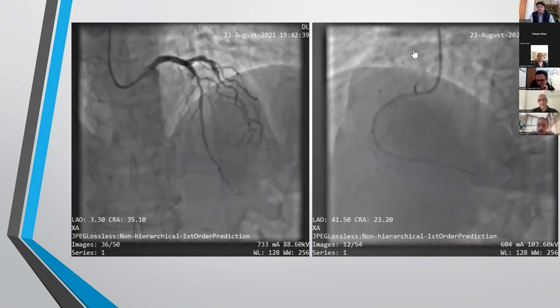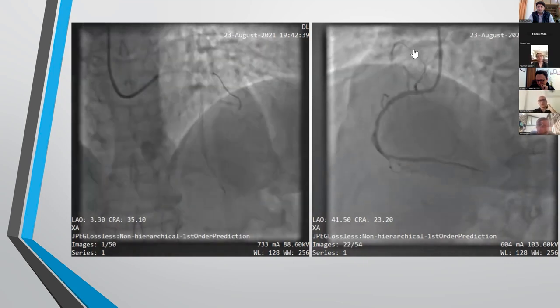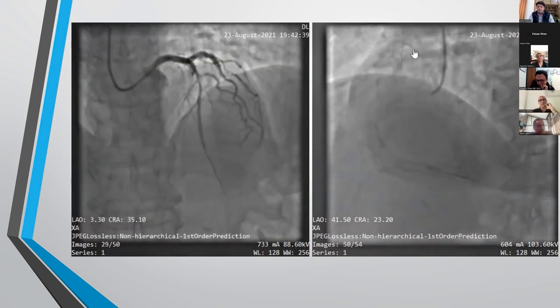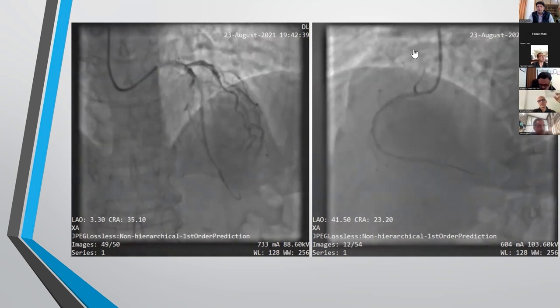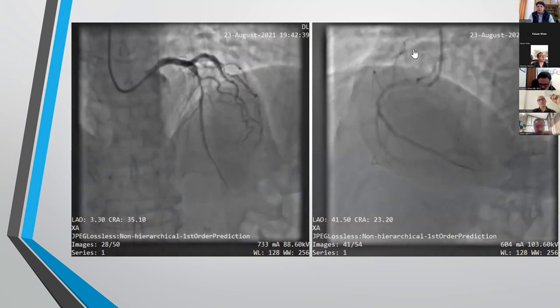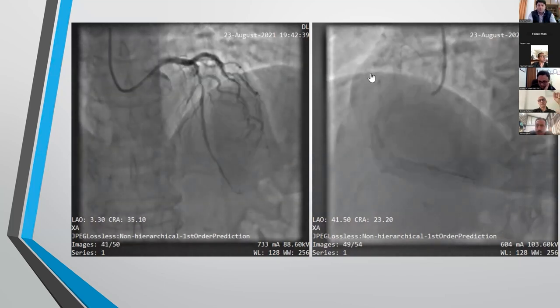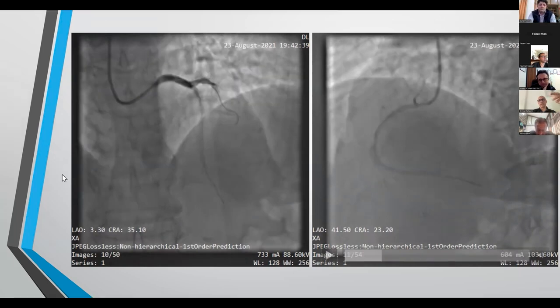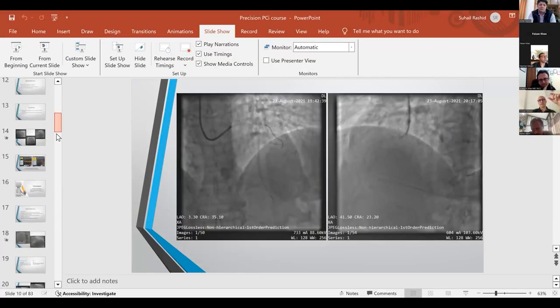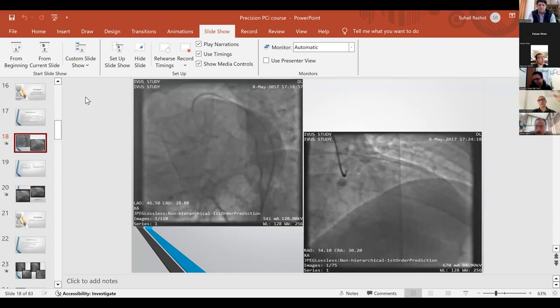Gee, I think first of all, great presentation. Really went over a lot of cases in different scenarios and use of IFR, FFR, and IVUS. I think there were two cases where the stents were undersized, and I think in both those situations, the treatment that was used was another stent within the stent. एक तो LAD का था, I think, which was a 2.5 millimeter stent in a vessel where the reference vessel size was 4.0 or greater.